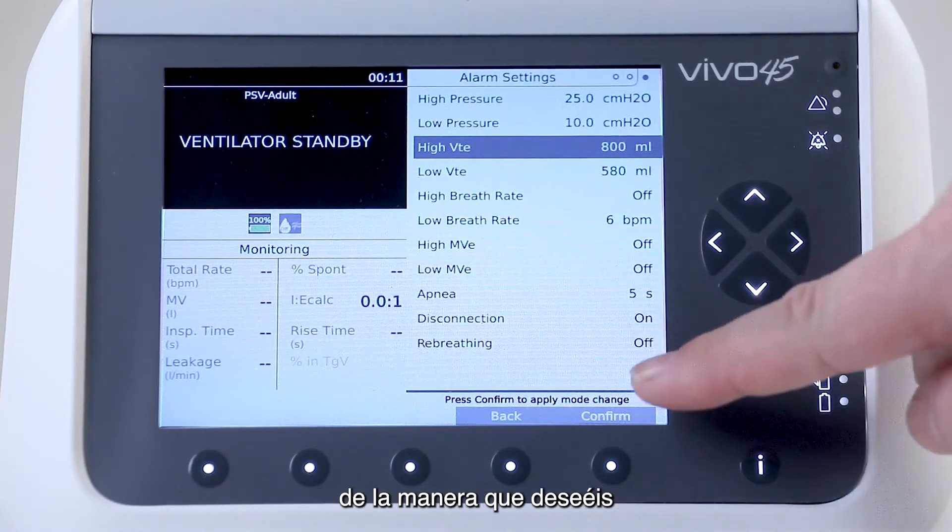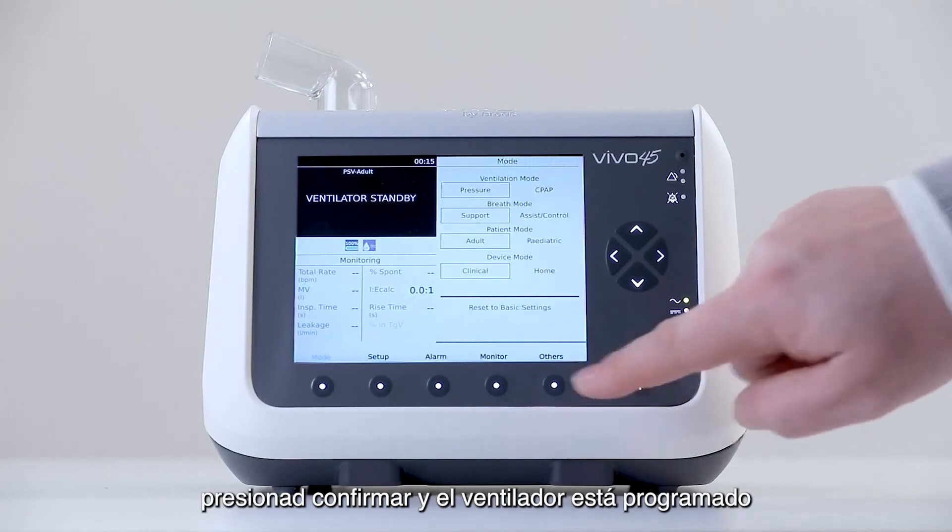When all alarms are set the way you want, you press confirm, and the ventilator is programmed to deliver pressure support ventilation.